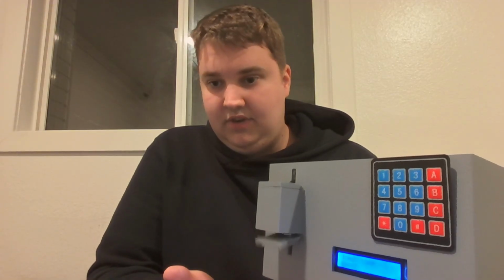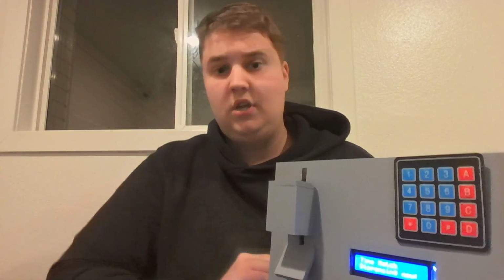Now we just wait for it to hit the correct time, and it does so, and the jingle will play, letting users know that it is time to come get their pills. The jingle both lets users know and gives a spacing break for the code so that we can initialize some other things, allow us to keep going in the code because it takes a certain amount of time to run. So in just a moment the jingle will be over.